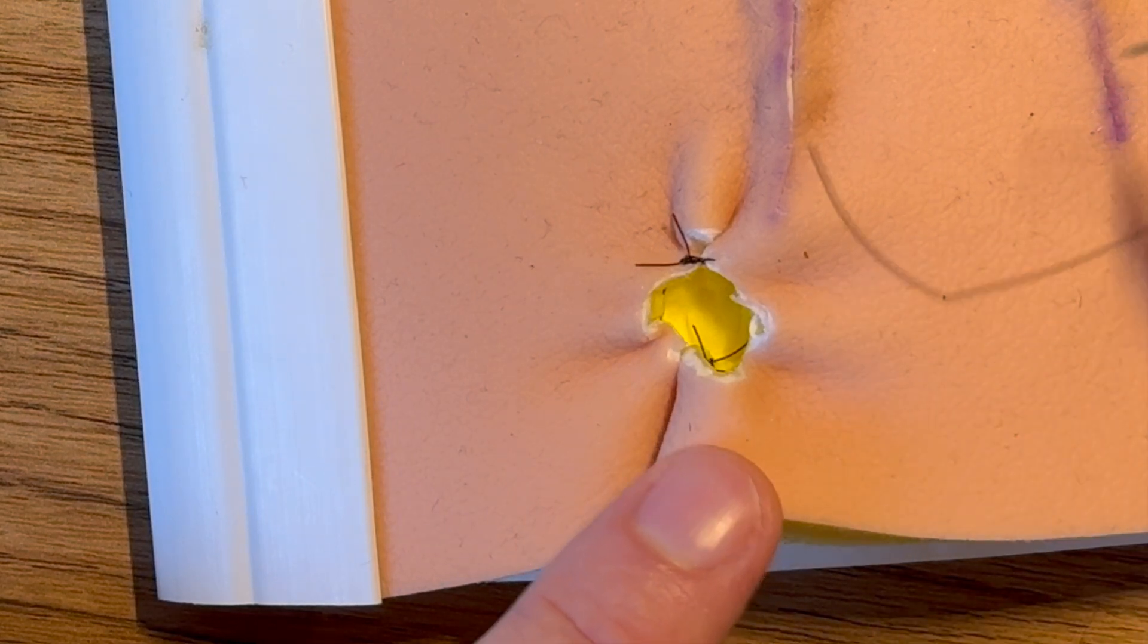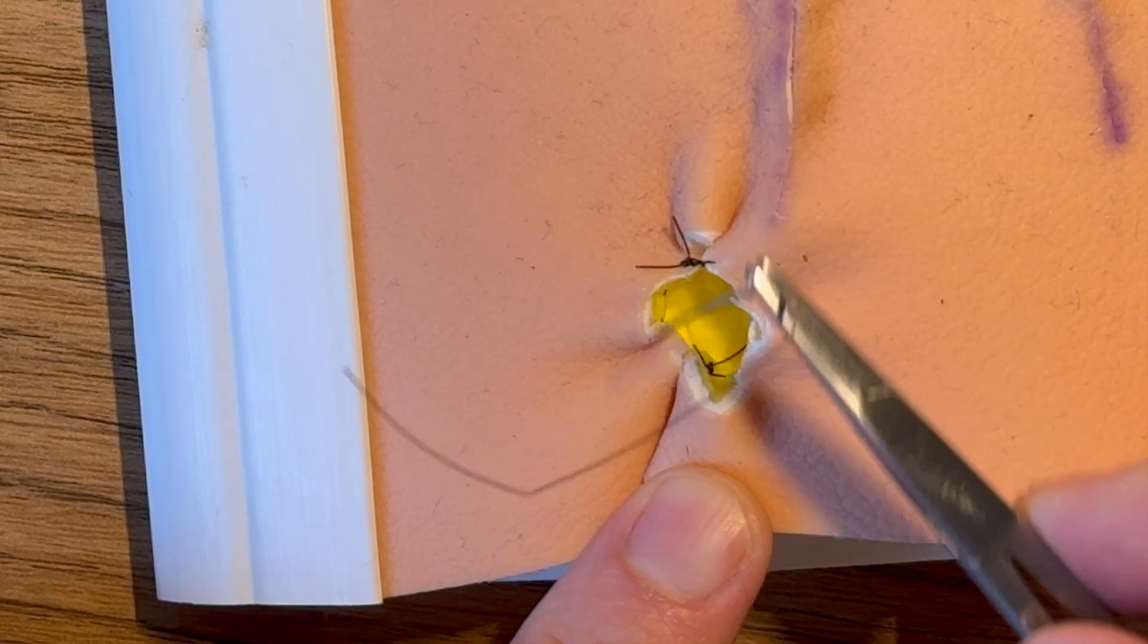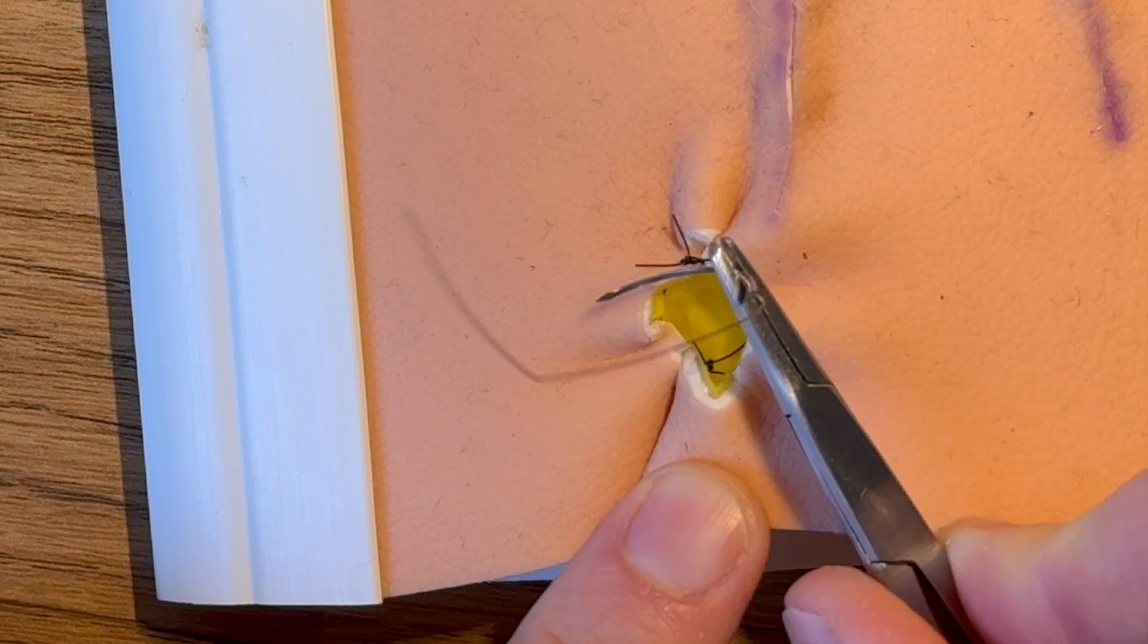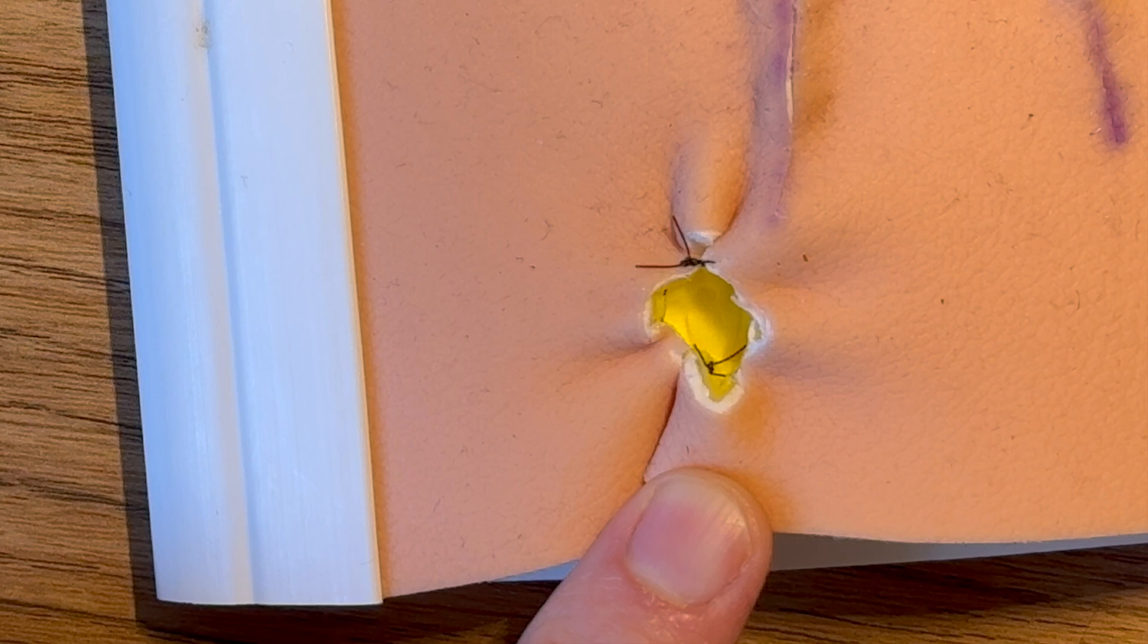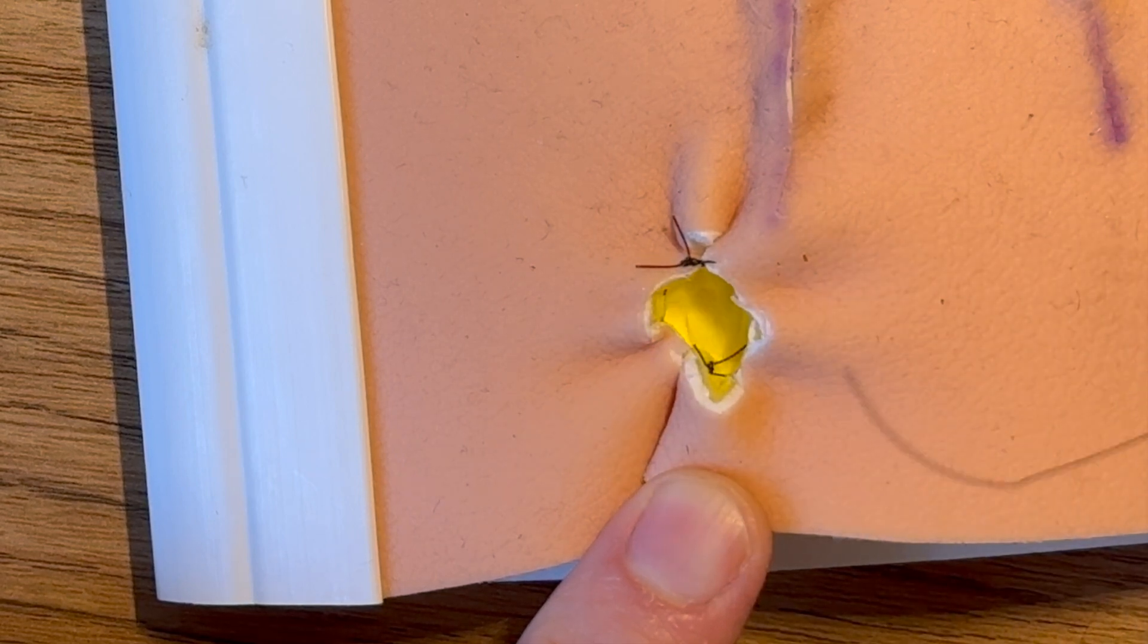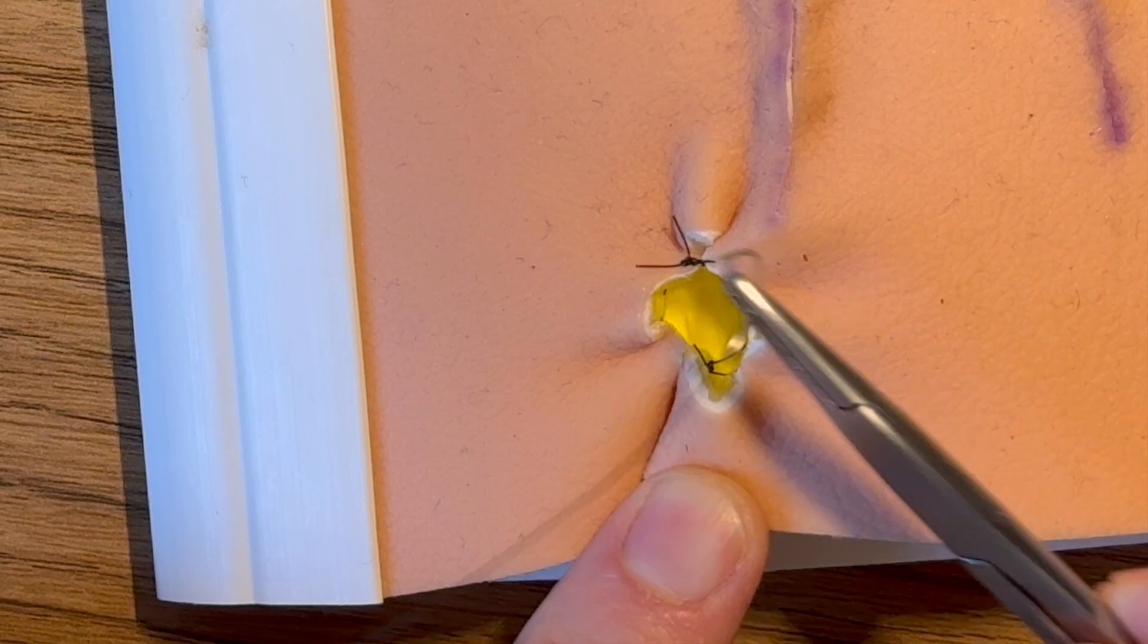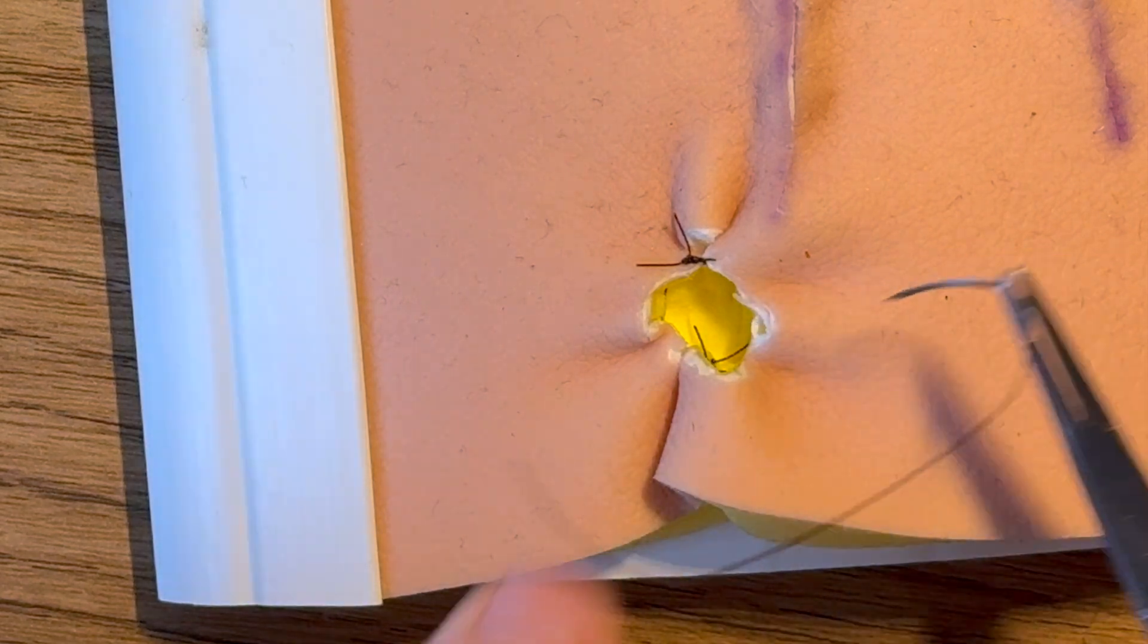The other thing is that you're going to fill in with very similar tissue as the surrounding, so you're not transplanting a graft from another area that may have a different color or texture that's permanently going to look like a bigger round mark that people don't necessarily like on an exposed scalp depending on their skin type. So although it's going to be lumpy and probably darker in color or reddish for the first few months of healing, it may end up being more similar to the surroundings and a smaller scar than if you just put a big pale graft or smooth graft in there.